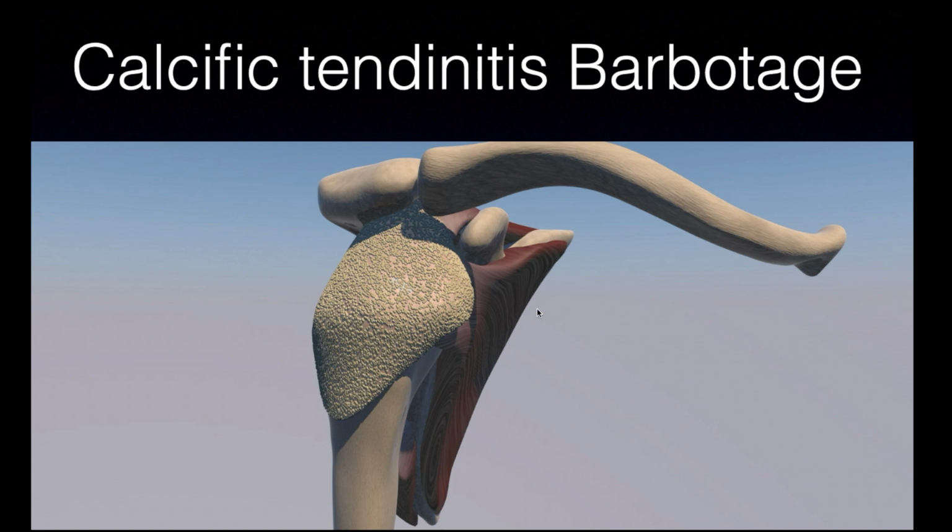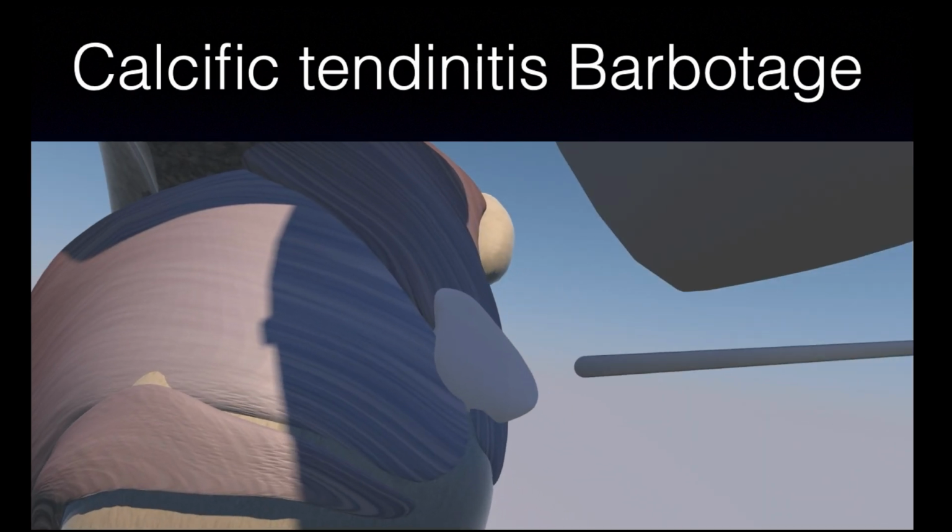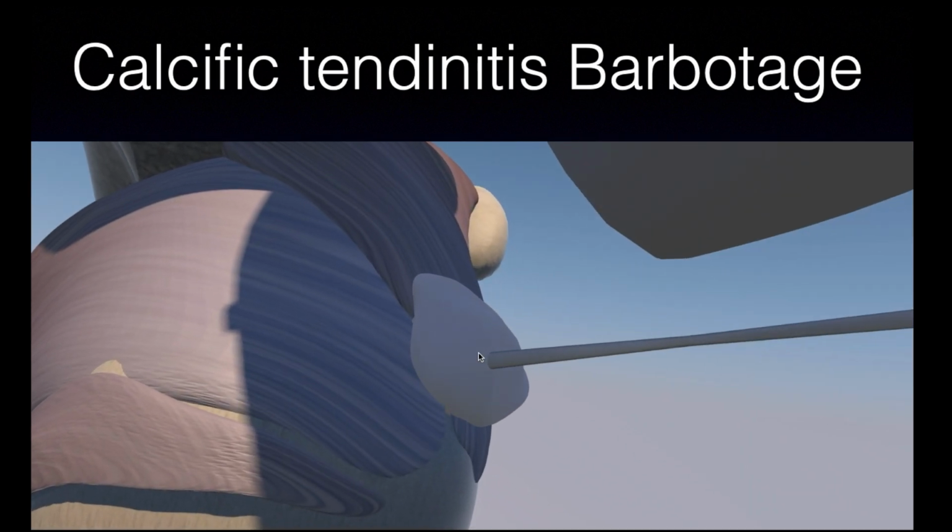Now we're going to jump to calcific tendinitis. We might have some other cases later. This is just a general picture of basically what Dr. Jacobson did. It's better just to do a one puncture technique and try to get your needle into that calcium glob, because then you essentially have a closed cavity.